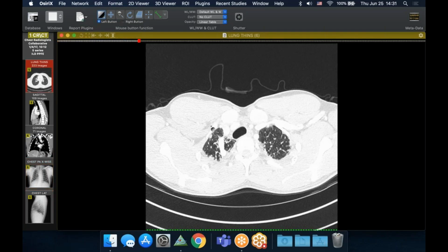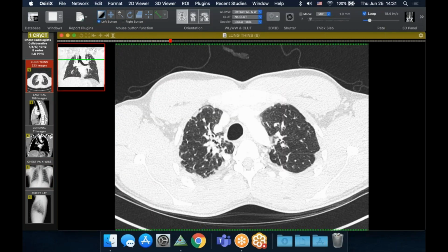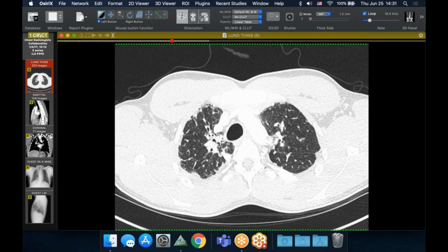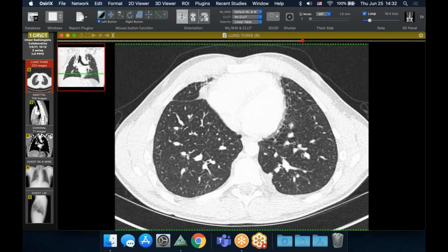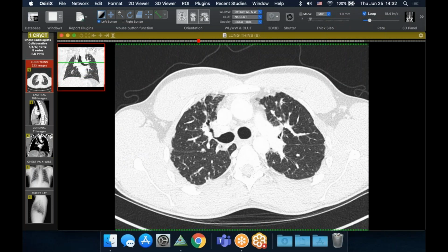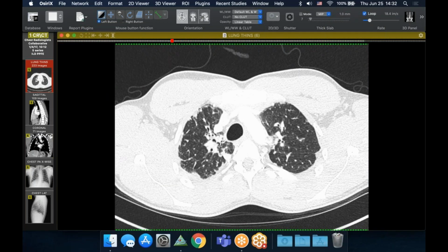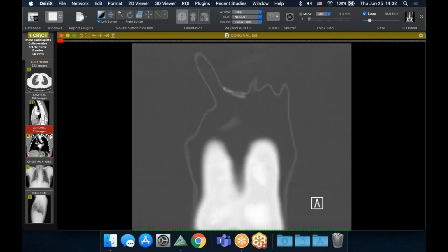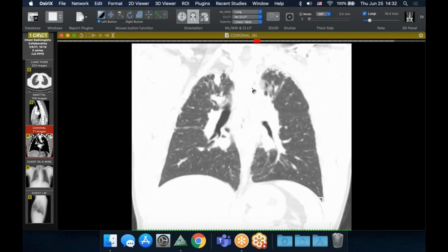And you can see on the CT, this was a pre-transplant CT, there's all this thickening up in the apex, not as bad as one would think for someone needing a transplant, but this is all pleuroparenchymal fibroelastosis. You see the bases are spared, and there's marked upper lobe volume loss. In my experience, they don't have a ton of visible stuff on imaging when they get really bad, but I think it's so rigid up there that the upper lobe's function is very diminished. Here's a coronal showing the thickening up in there.